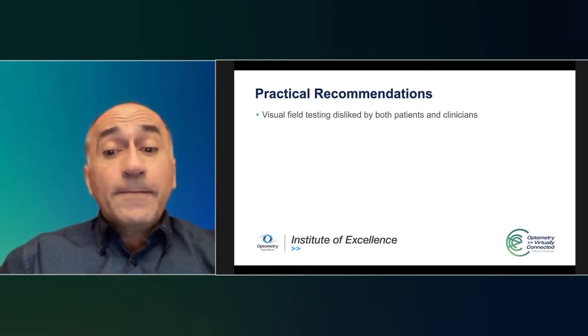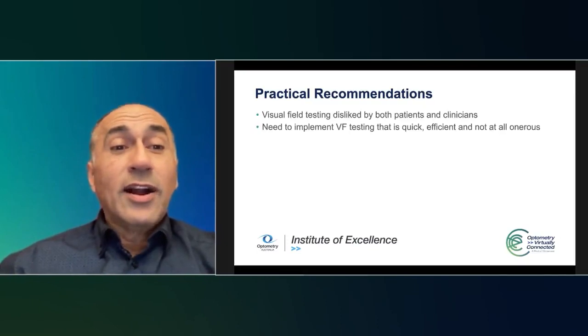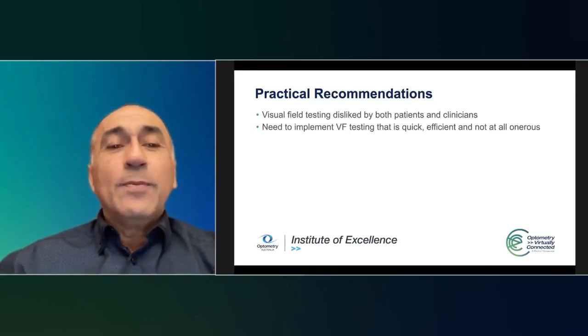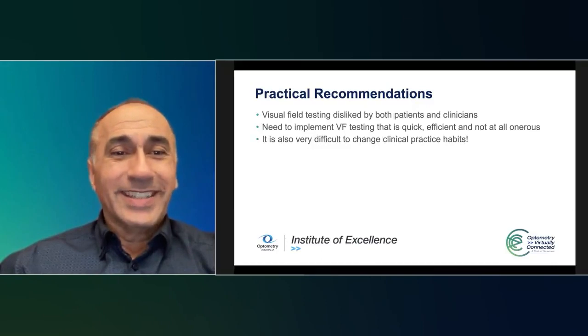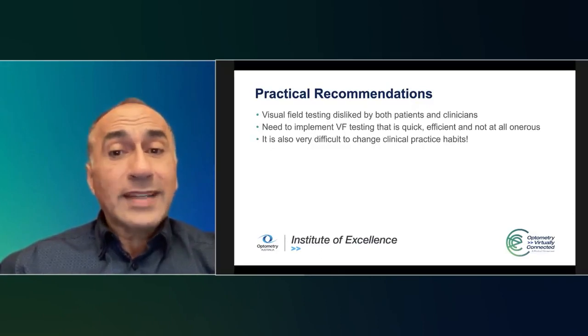Visual field testing is disliked by patients and disliked by clinicians. I know that personally. Anyone who treats glaucoma knows that. So because of that, we need to implement visual field testing that's quick, efficient, and not onerous on the practice or the patient. It's also to be noted that it's difficult to change clinical practice habits.